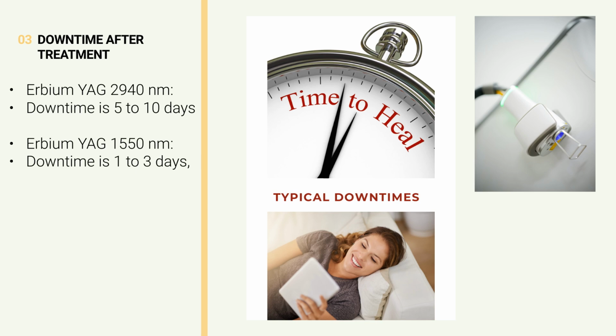The 1550 nanometer wavelength offers a faster recovery time, typically between 1 to 3 days, with mild redness and swelling. It is non-ablative, so healing is quicker, allowing patients to return to normal activities within a day or two. Results are more gradual over multiple treatments.